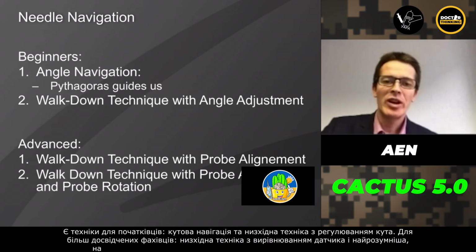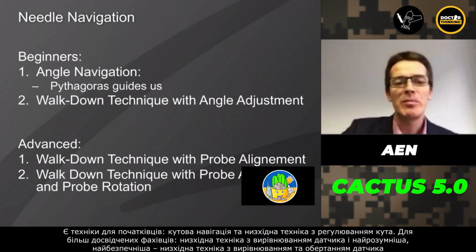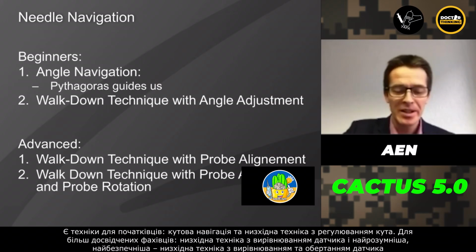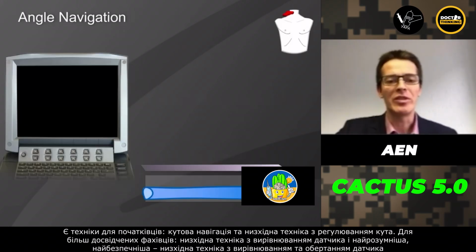So we have divided these methods into those for beginners. We talk about angle navigation and a walk-down technique with angle adjustment. And for more advanced users, we talk about the walk-down technique with probe alignment. And at the end, the smartest and, as we believe, the safest technique is the walk-down technique with probe alignment and probe rotation. So let's go over this.